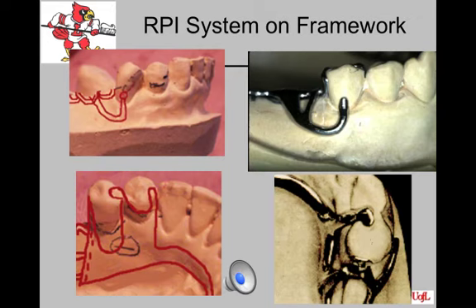And then a pod is created where the I-bar from the point of touching the tooth extends upward along the surface of the tooth for another at least 2 millimeters. So this provides a little pod where it's not just the point or the tip of the I-bar touching, but an area of 2 millimeters that touches the tooth up to the survey line.